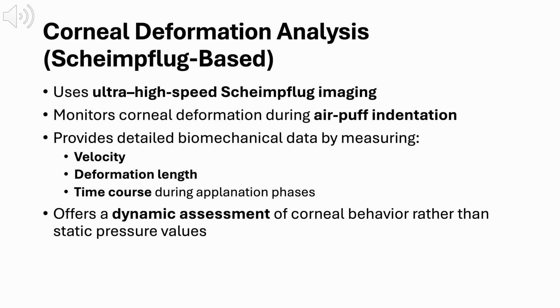The key advantage is that this approach provides a dynamic assessment of corneal behavior. Rather than treating the cornea as a static surface with a pressure reading, it evaluates how the cornea responds to force over time, which is far more reflective of its true biomechanical properties.